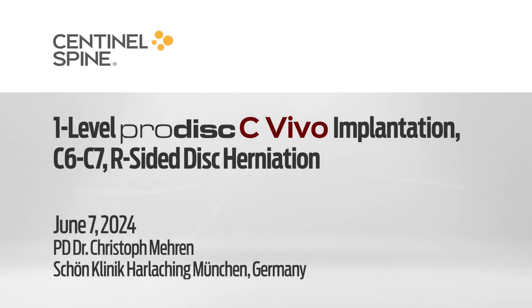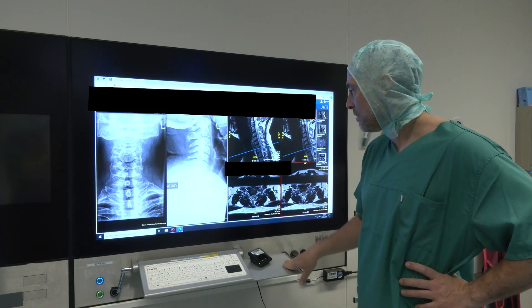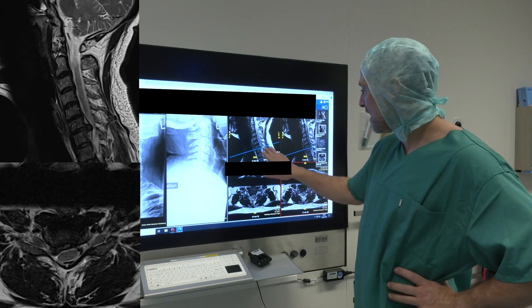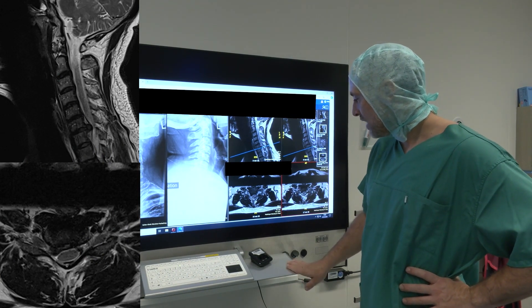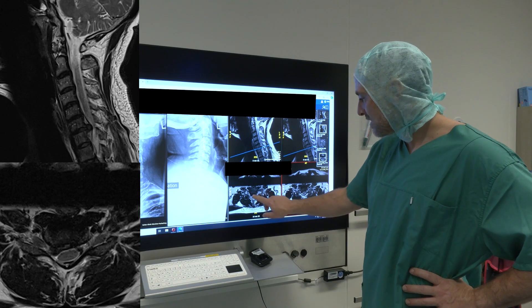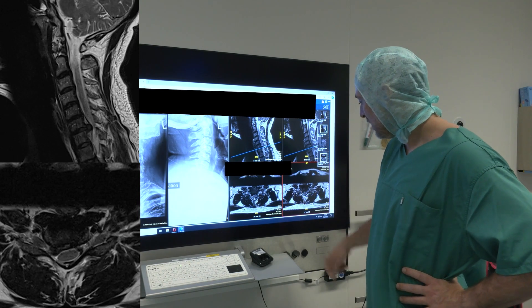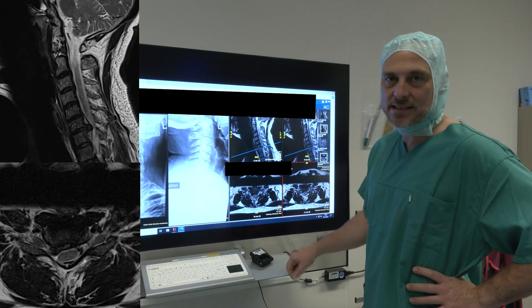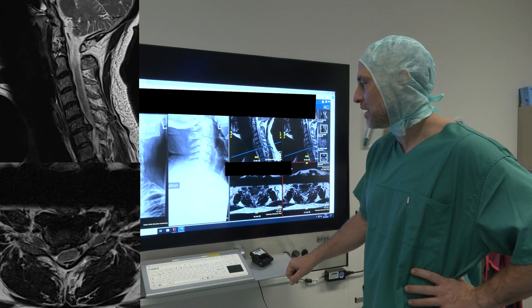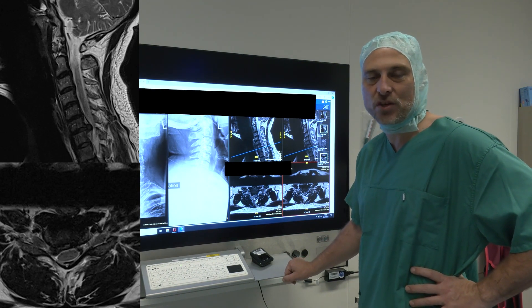The first case is a 49-year-old male patient with an acute onset of right-sided radiculopathy. You see here the X-ray and the MRI with this clear finding of a medial-lateral disc herniation at C6-7 to the right side. It started pretty medial and it's going down into the neuroforamen, pushing the C7 nerve root. He had six weeks of conservative treatment without improvement, making him a perfect candidate for total disc replacement after decompression at C6-7.